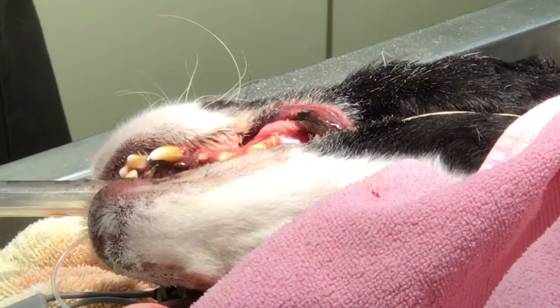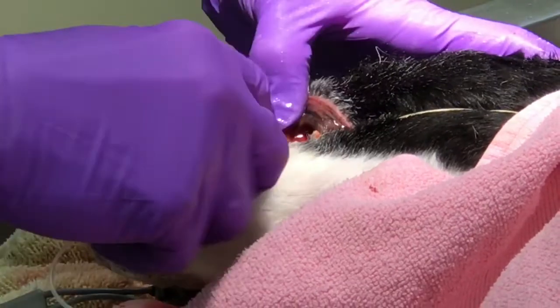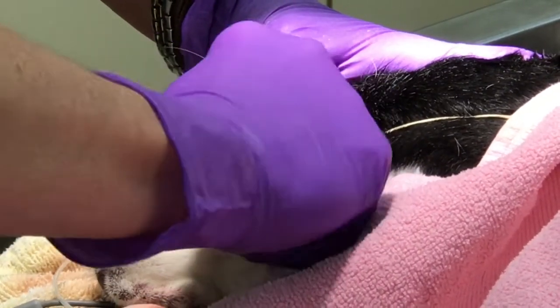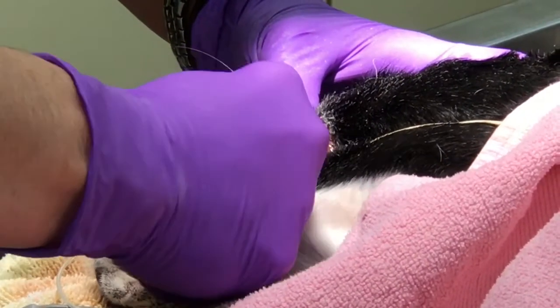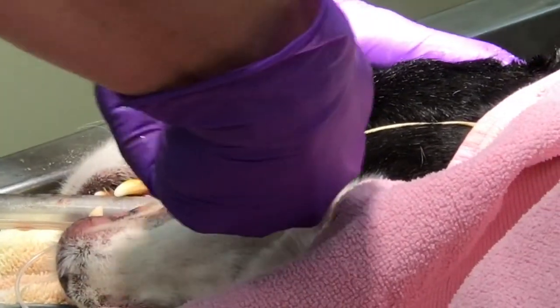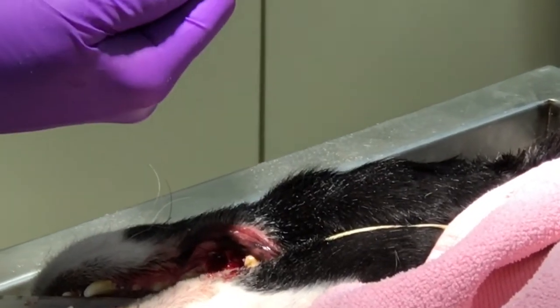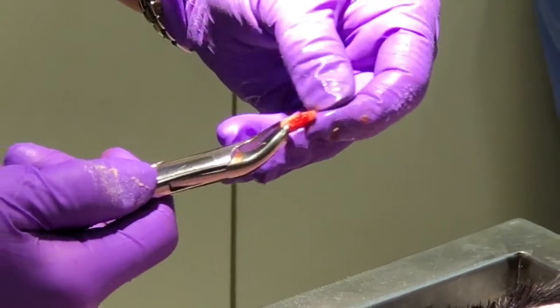And we'll try to get this next root out. The goal is to always get the roots out intact and hopefully not fracture them, as fracturing them just causes more work. And having that little bit of a wad of sticky material at the end shows me that we did have an abscess forming.